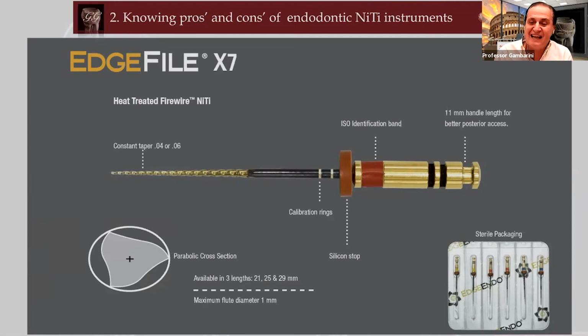About the instrument itself, they come from a sterile package, so you don't have to sterilize at the beginning. If you're using them single use, there's no issue. If you want to reuse them, we tested that the normal disinfectant does not affect any properties of the instrument, including the one coming from the heat treatment.